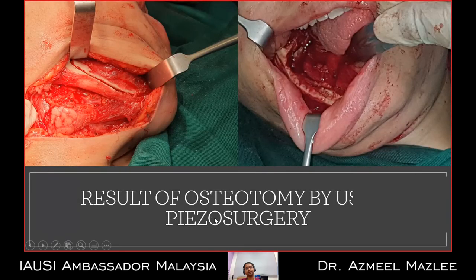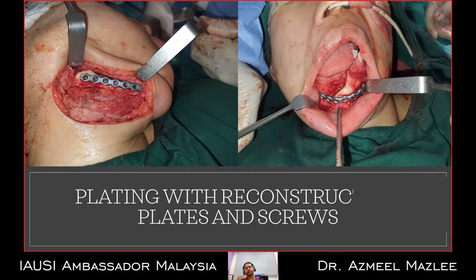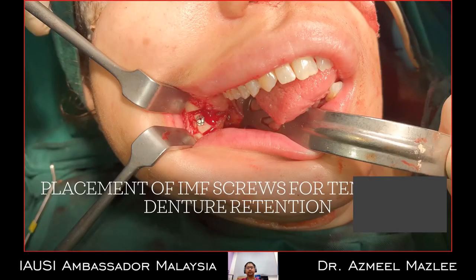The results of the osteotomy cut show a very nicely cut specimen with preservation of the lower border of the mandible, and intraorally, an almost very clean cut. In this case, we had to sacrifice the inferior dental nerve because it was involved with the lesion. We then placed the pre-bent plate with only minor adjustment, saving almost half an hour of intraoral bending time. After placement of the reconstruction plate, we placed IMF screws for temporary denture retention.